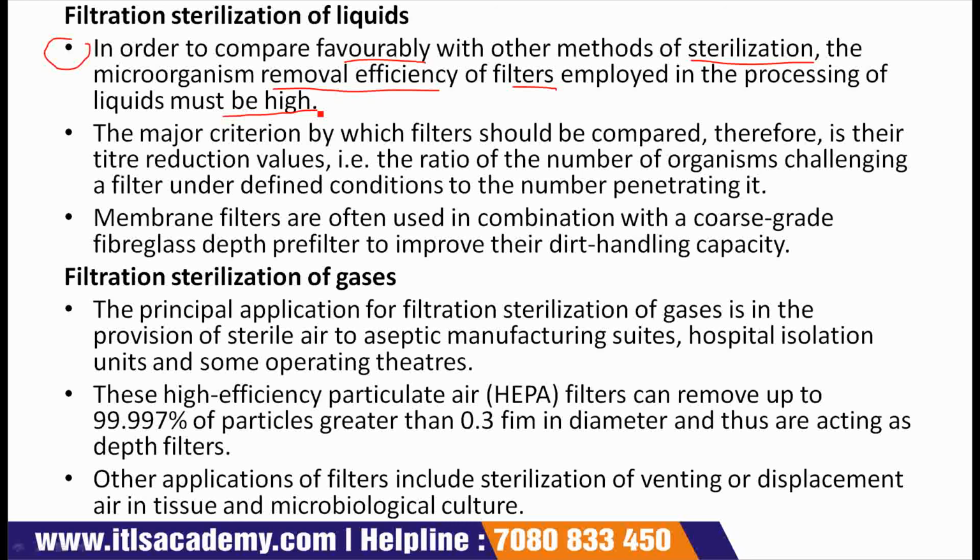It may be tempting to assume that the pore size is the major determinant of filtration efficiency, and two filters of 0.2 micron pore diameter from different manufacturers will behave similarly.